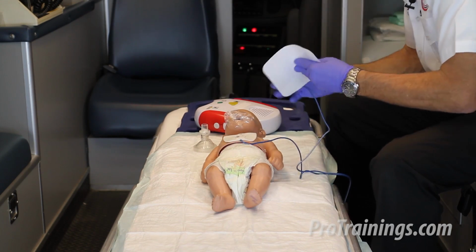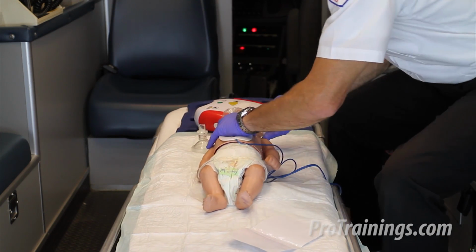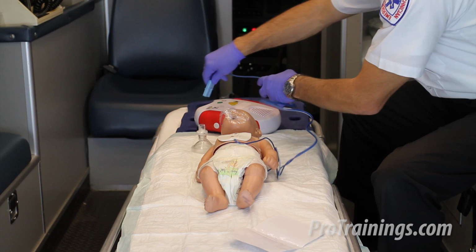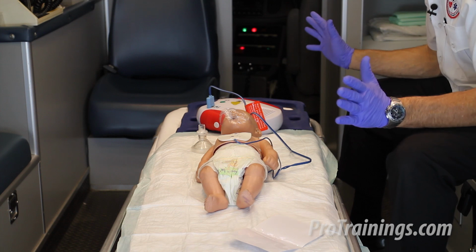Plug in connector. I'm going to carefully roll the baby onto their side, place the second pad on their back, and lay them carefully back on their back. Check connector and pads. Plug in the connector. Analyzing rhythm. Everyone stand clear. Clear.